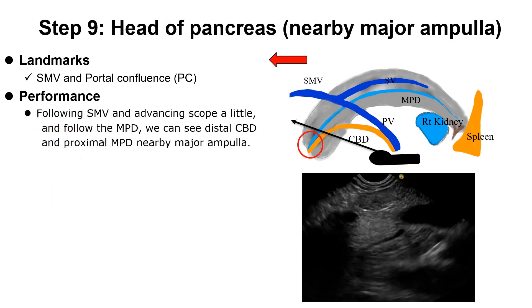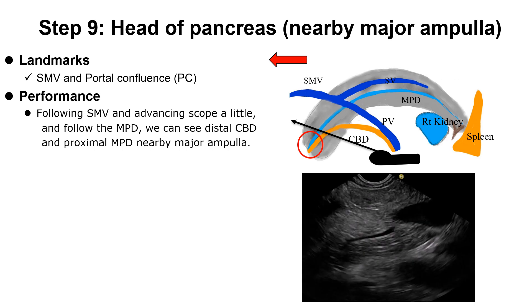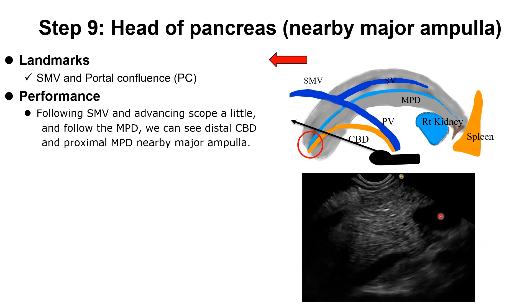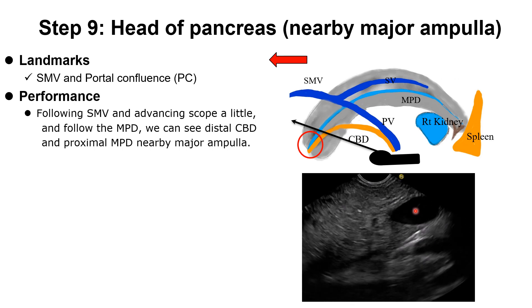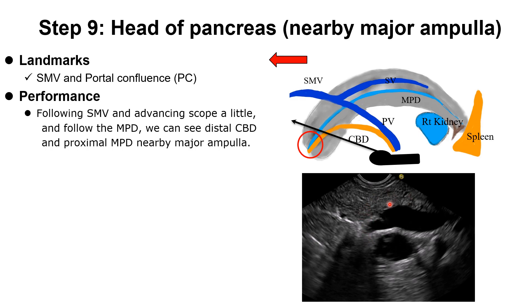Step 9: Pancreas head area. Good landmarks here are the SMV and portal confluence. Following the SMV and advancing the scope slightly, we can see the main pancreatic duct, distal CBD, and the area near the major papilla. Video clips show the main pancreatic duct area and CBD. The portal confluence connects to the SMV, and we can see the pancreatic neck area.